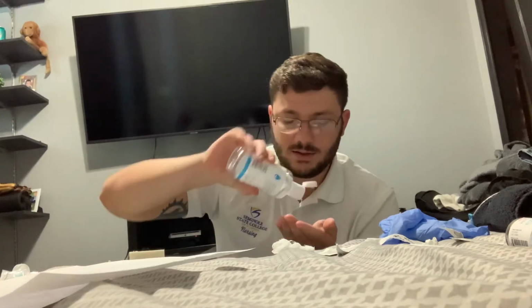I've identified that. So now I'm going to knock on the door, enter the room, and foam in. Hello, my name is Nunez. I'm going to be doing your injection today. Can we start off with your full name and date of birth? So she'll say Anna Pawlowski, 5/5/1957. And I'm going to compare that to the chart, which she has on her band, 2 identifiers. And then I'm going to ask her if she has any allergies. She'll say, yes, I'm allergic to penicillin. I see that on her band it also says she's allergic to penicillin. I will compare that to the chart.